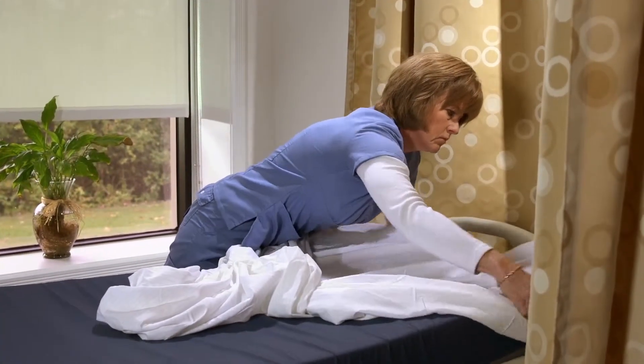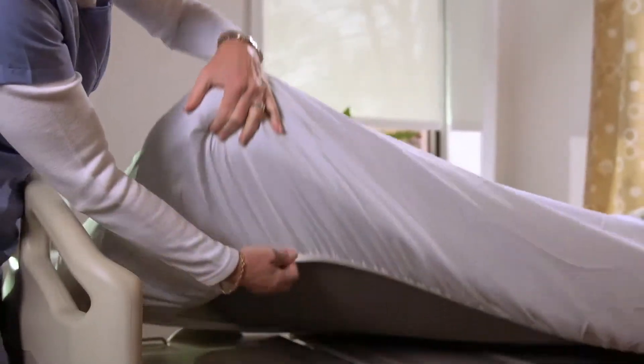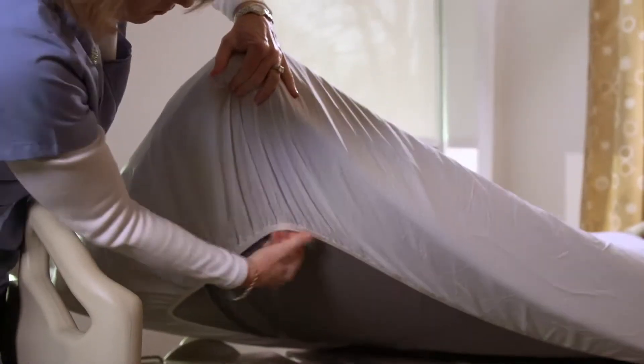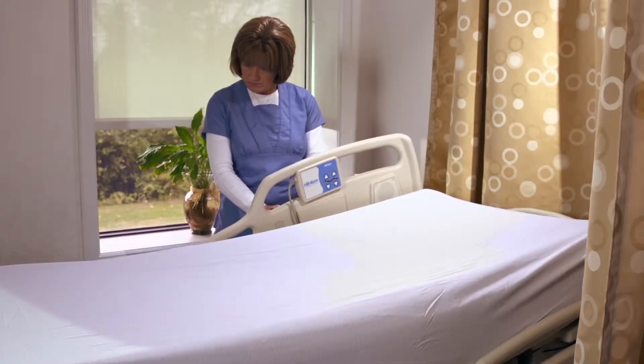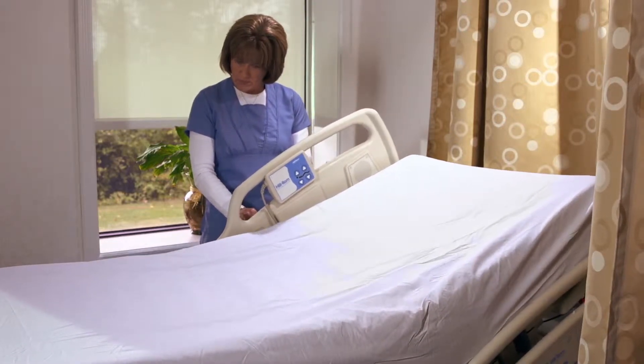Tuck both ends at the head of the bed, then both ends at the foot of the bed. Be sure to tuck the elastic all the way underneath the mattress all the way around. Whether the bed is in a flat position or the head of the bed is elevated, the Dermatherapy fitted sheet stays securely on the mattress.